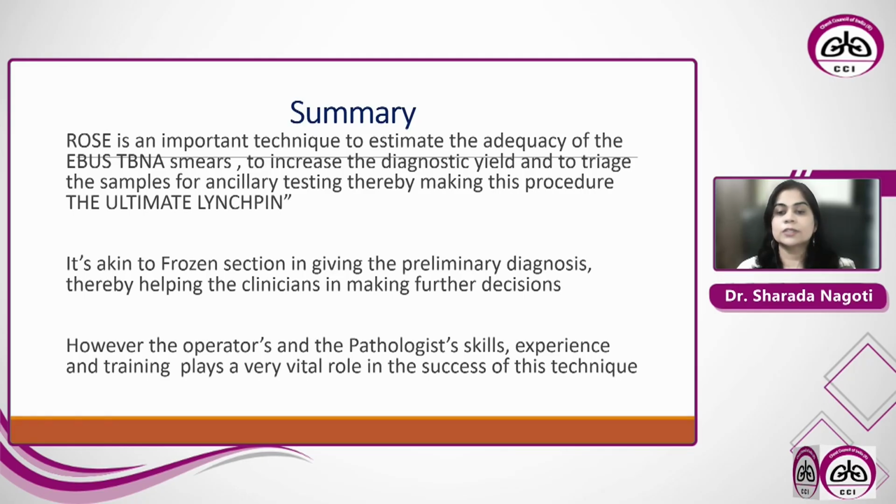However, the operator's and the pathologist's skills, experience, and training play a very vital role in the success of this technique.